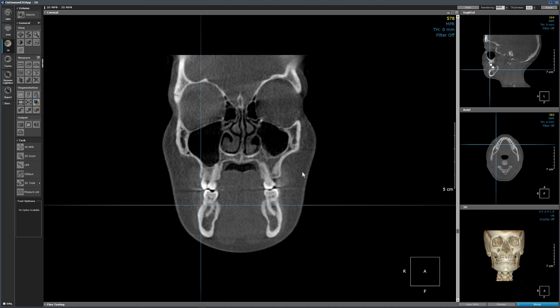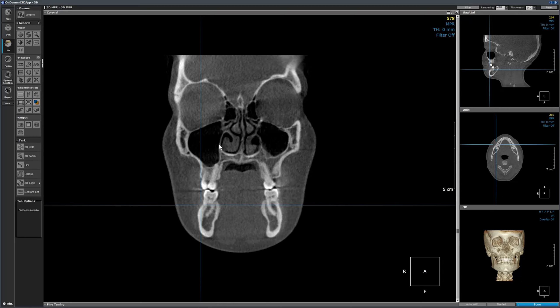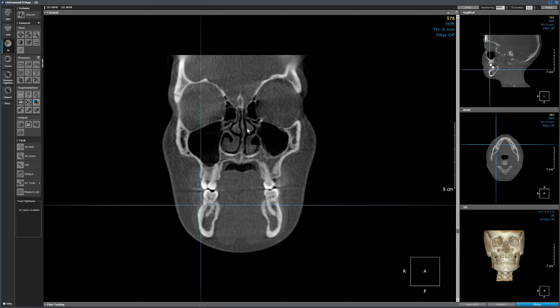Here we can see the left maxillary sinus and the right maxillary sinus. To understand which side is which, the software will indicate R for right. F stands for foot of the patient, or the inferior part of the body. We can see the inferior turbinates and middle turbinates. We have the orbits — right orbit and left orbit. This is the crista galli.